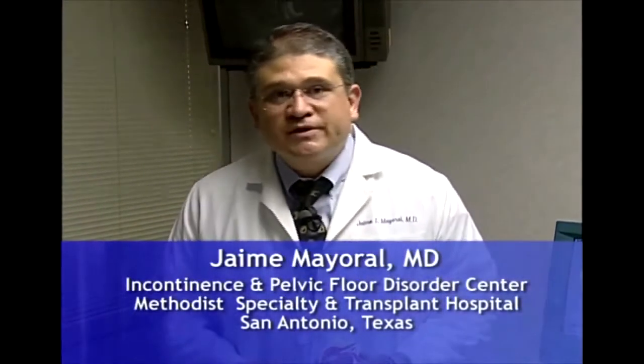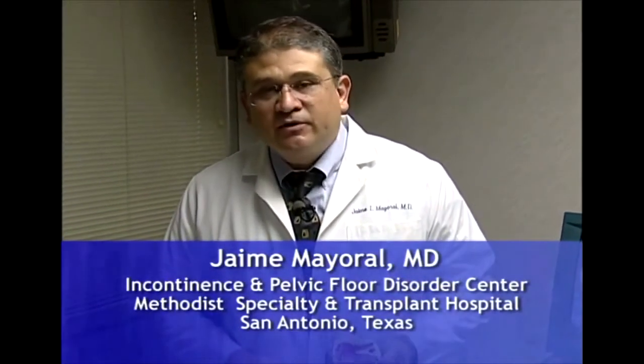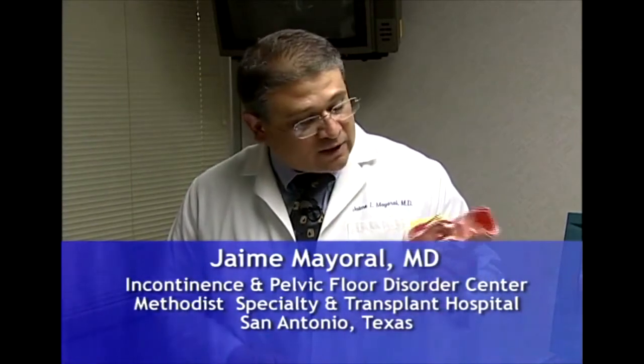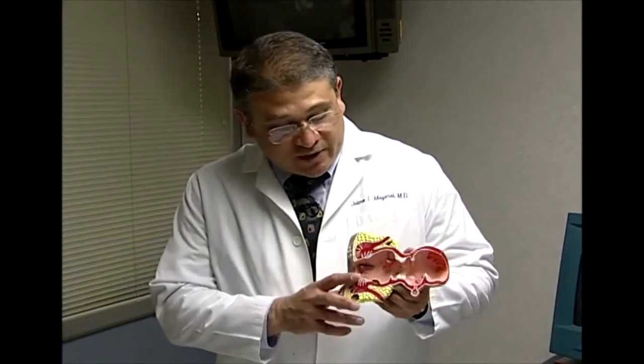I'm a colorectal surgeon here in San Antonio, Texas. I'm here to demonstrate how I do the pudendal nerve latency. And I'd like to start with this model to demonstrate how the patient is placed. The patient is usually placed in the left lateral decubitus position.